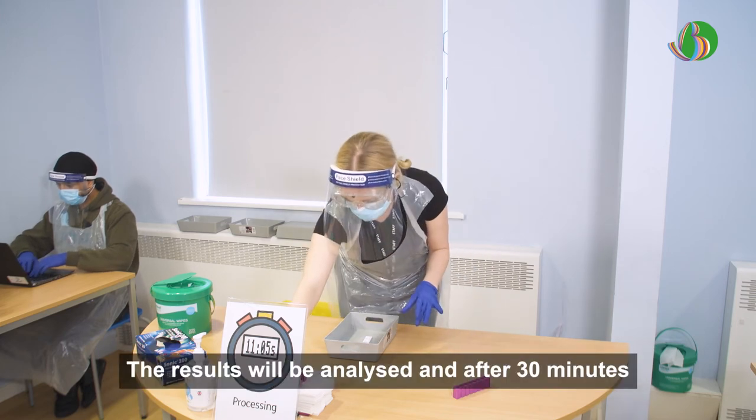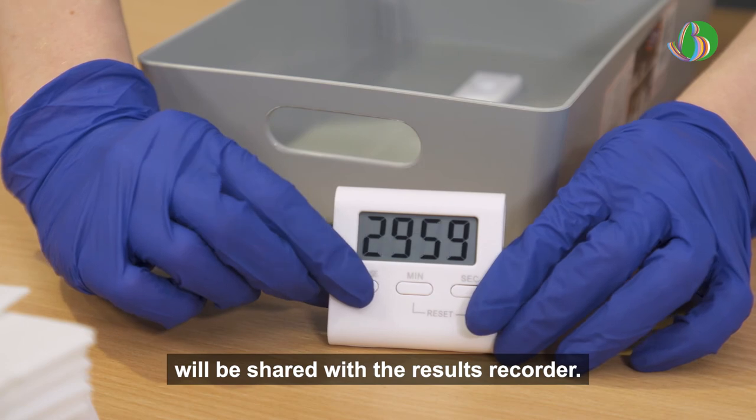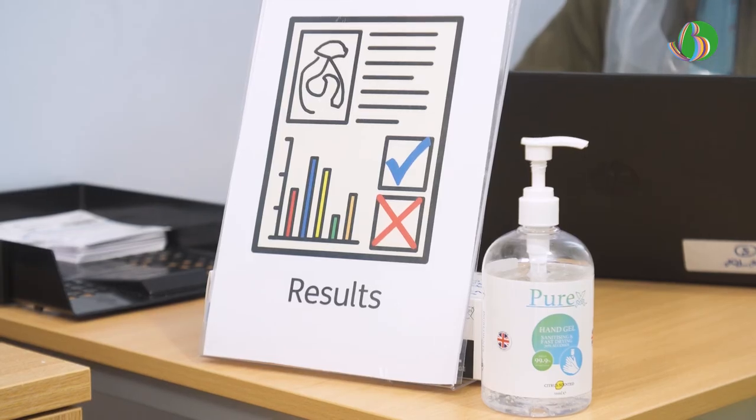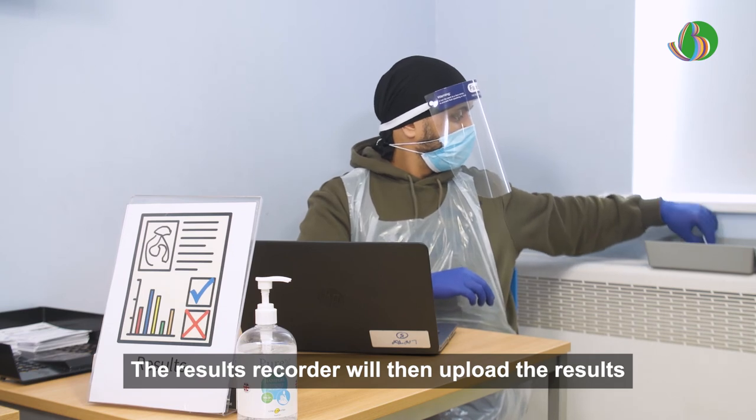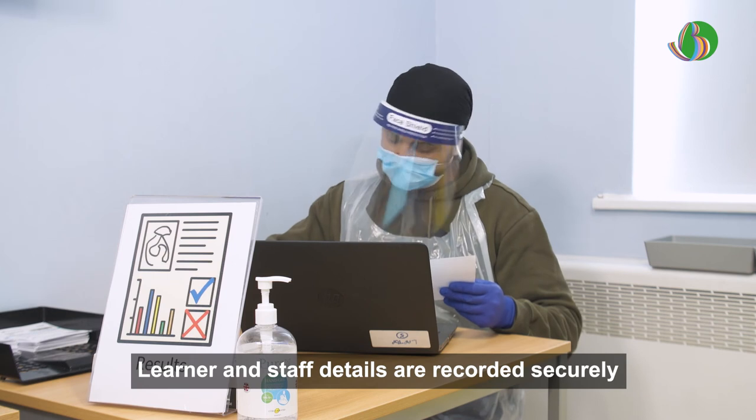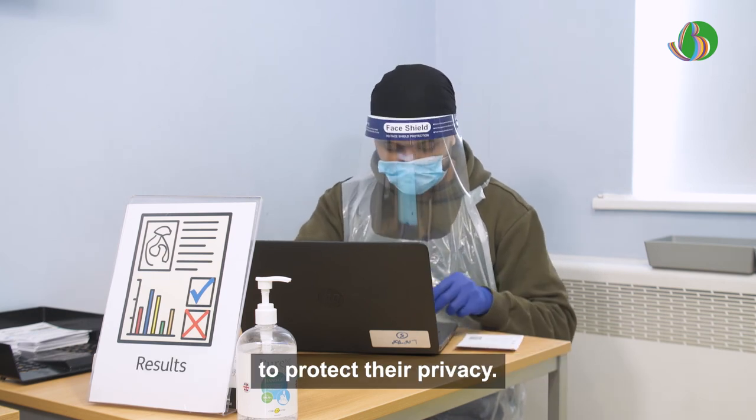The results will be analysed and after 30 minutes will be shared with the results recorder. Results. The results recorder will then upload the results into the national database. Learner and staff details are recorded securely to protect their privacy.